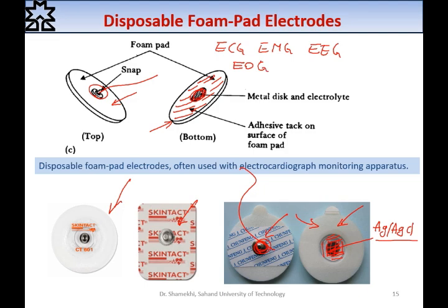And I should emphasize that the quality of the recorded signal is related to the price of the electrode. If you want to have good recordings, you need to buy high quality, high price. You should pay more money to have good recordings.